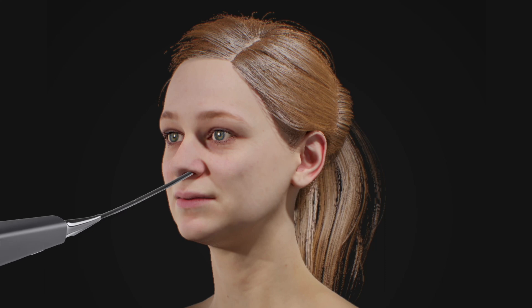The first two methods are done without any sedation. The nose is first sprayed with a nasal decongestant and a numbing agent. This is followed by injection of a local anesthetic into the airway space immediately below the vocal cords. A fiber-optic endoscope is then threaded through the nose down to where the vocal cords are located.